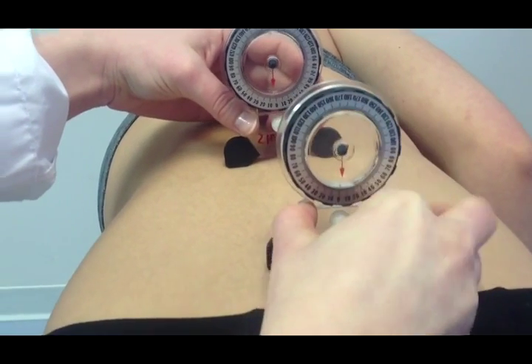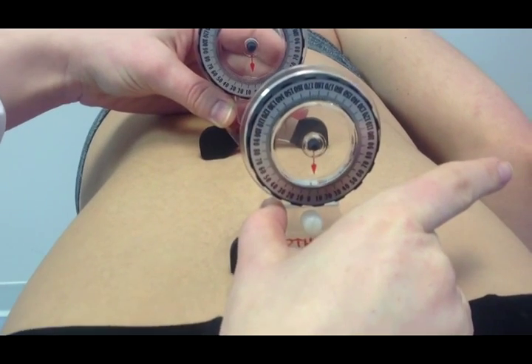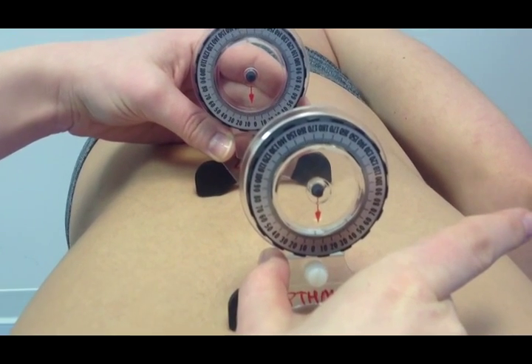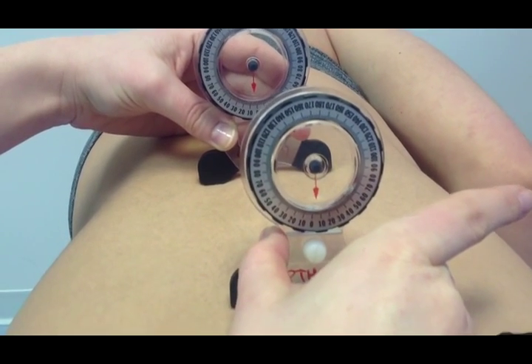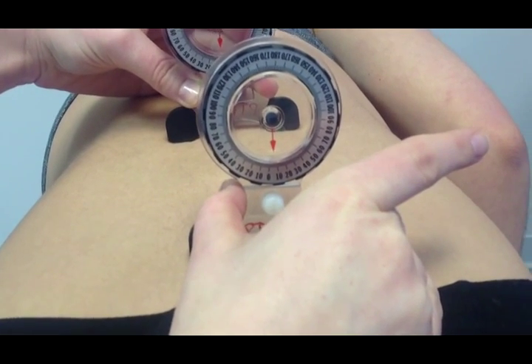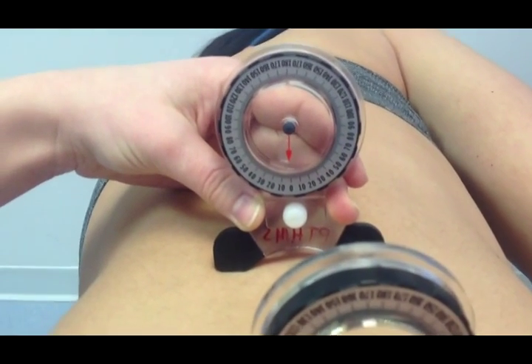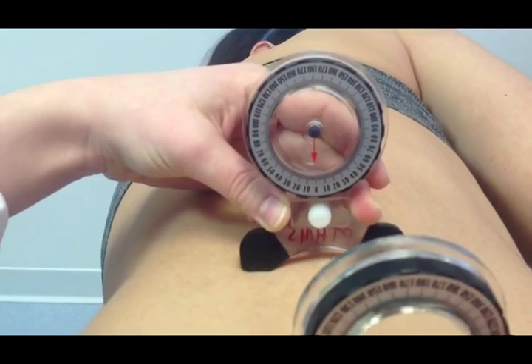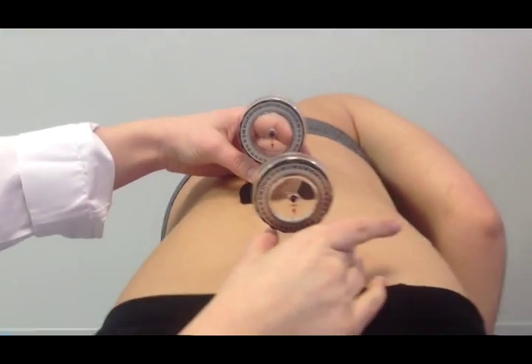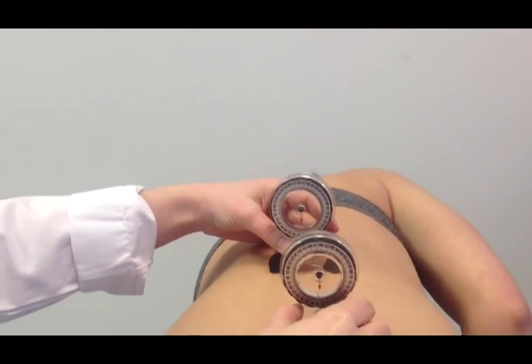Once the patient is rotated, you want to read both inclinometers and take the difference between the two. I'm looking at the inclinometer at S1 and reading it at about 4 degrees. By taking the difference between the two inclinometers, I have 4 degrees of lumbar rotation.